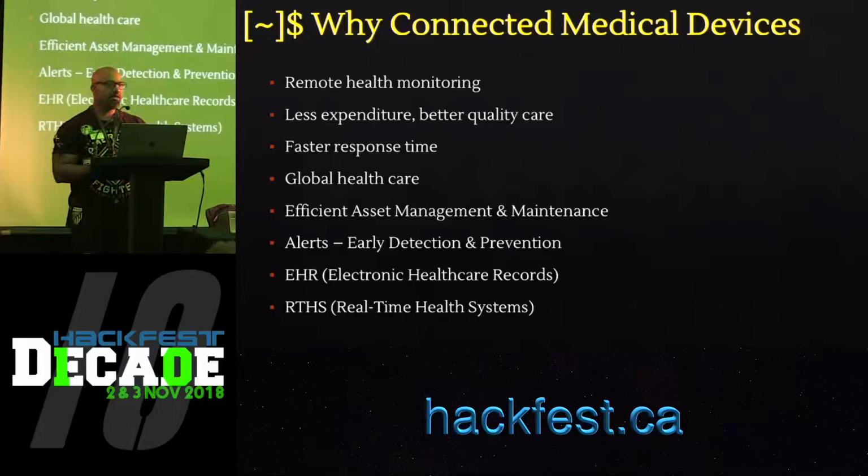Well, in our lab setup, we just had an infusion pump, so it wasn't connected to any network. We didn't have any pump server or any other components that usually talk to the infusion pump. So all we had was an infusion pump. In the lab, we made some initial observations.